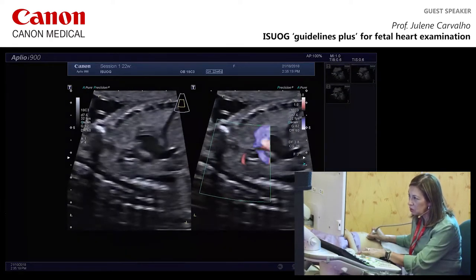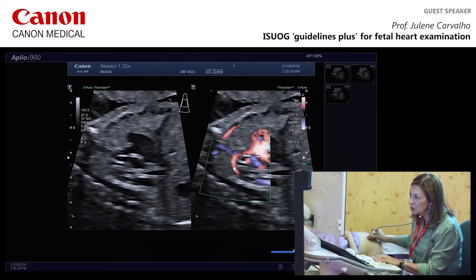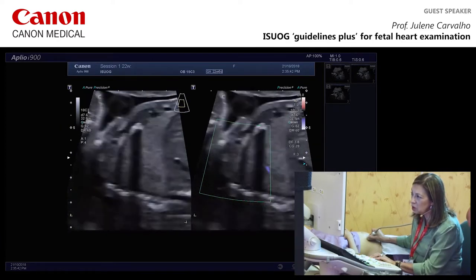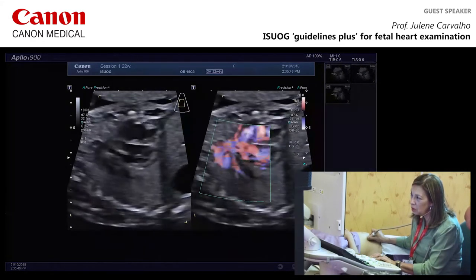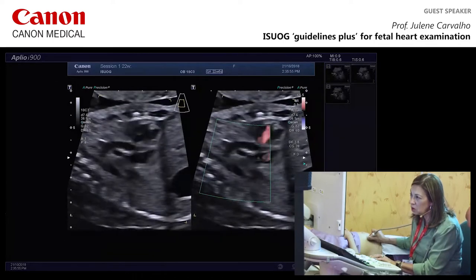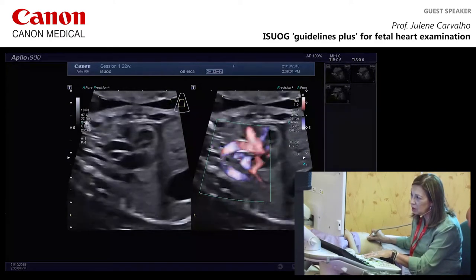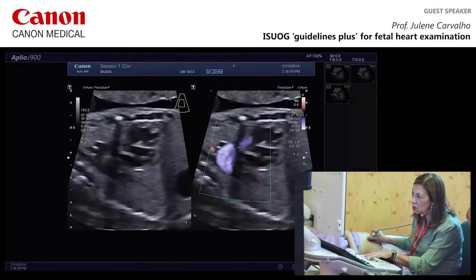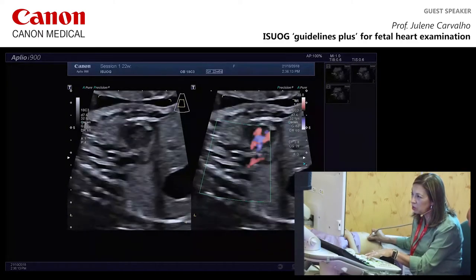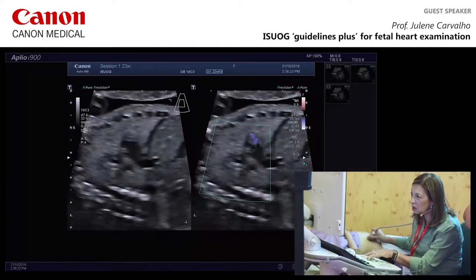Adding color to the sagittal view — you can see how much information this gives. The normal azygos vein is visible coming into the superior vena cava, which drains into the right atrium. By splitting the image, you can see the superior vena cava, right atrium, and azygos — don't confuse this with the aortic arch. The aortic arch is coming in separately, then the pulmonary artery. Adjusting velocity: for veins, decrease the velocity; for arteries, increase it to clean the image. Too low a velocity in the arteries gives aliasing and makes structures harder to see.